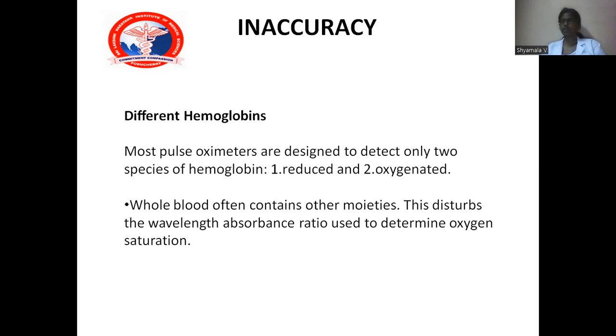The main disadvantage is it gives erroneous reading when the patient is having hypothermia, or poor peripheral circulation, or with the infusion of vasoconstrictor drugs. It can also be affected by placing the finger probe on the same side as the non-invasive blood pressure cuff. However, the pulse oximeter does not generate an alarm during the inflation cycle.